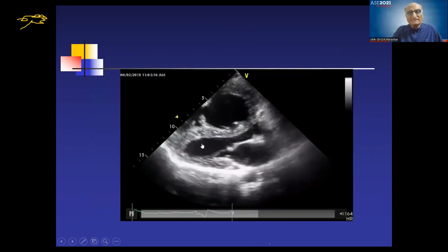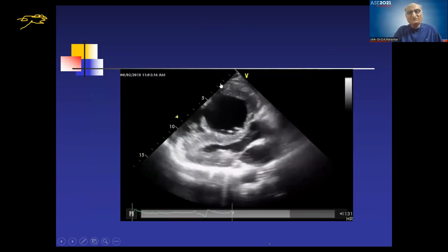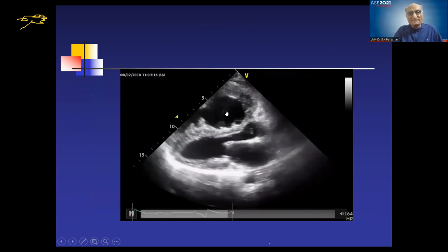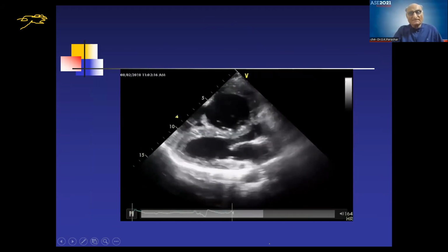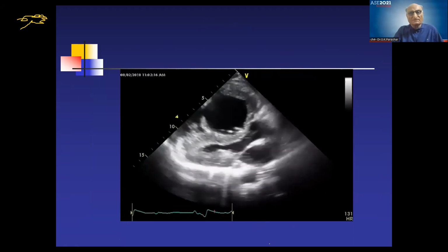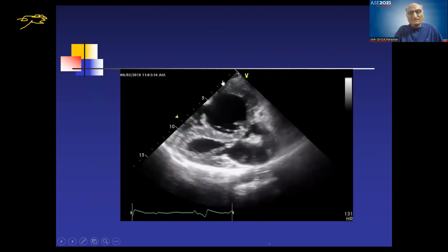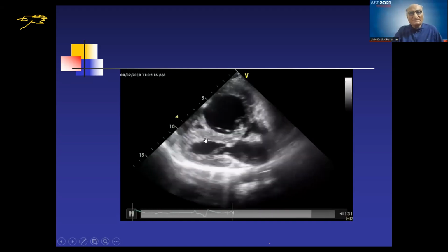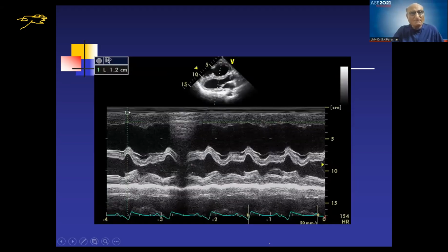And you see here, this is the same patient. Now, what do you see in the parasternal long axis view? You can see significant RVH. And you see this is the right ventricle. The right ventricle is enlarged in size, pushing the septum posteriorly with a small LV. And there is an abnormal motion of the interventricular septum, which will be shown better in the M mode. So if you're asked to comment here, you can say right ventricular hypertrophy, RV is enlarged and the LV is small.